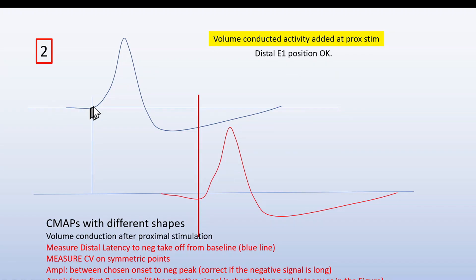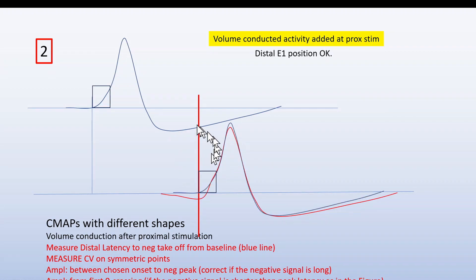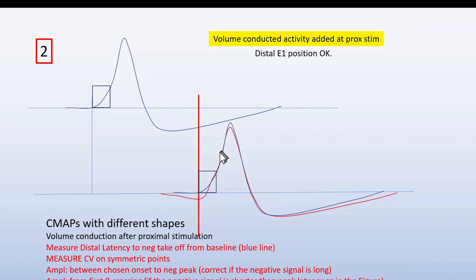Here is another situation where we have a very good signal at the proximal stimulation but a different shape at the distal stimulation. For example, in median stimulation, we have early components here in the positive-going direction — this is the volume-conducted activity from forearm muscles. In this situation, we measure the distal latency to this takeoff, but for conduction velocity we use symmetric points. One way to do that is to superimpose: placing the blue signal here, you can see the blue takeoff and the similar takeoff for the proximal stimulation, with this as a new baseline and this as the first takeoff from the baseline. This is based on an absolute superimposition of the signals.